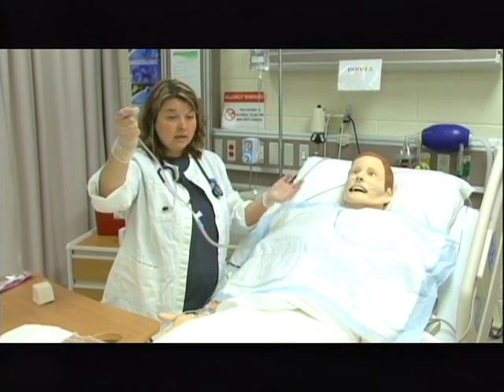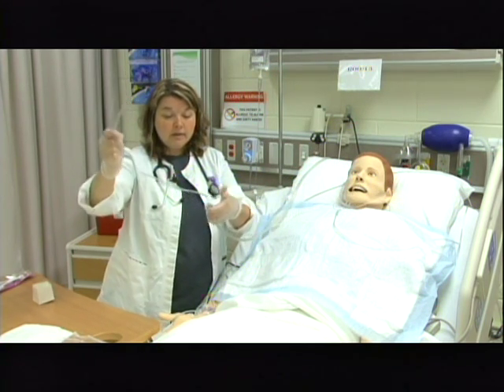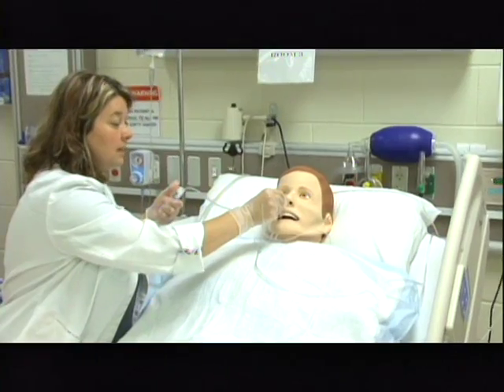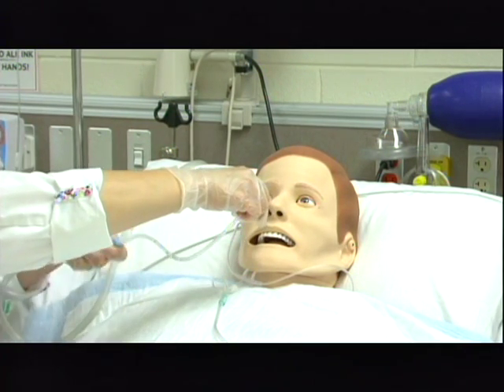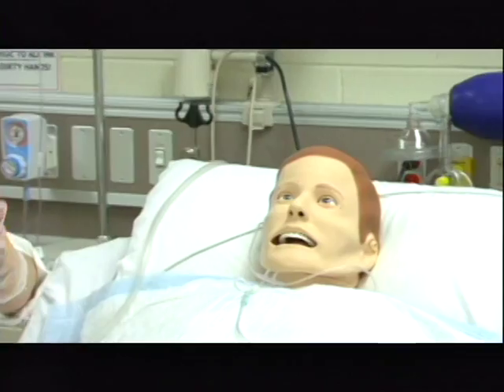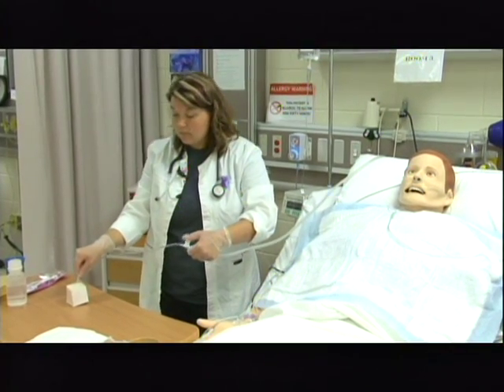Mr. Smith tells me he still has secretions, so I wait at least 30 seconds to a minute between suction passes. I allow him to catch his breath, have him take another couple of deep breaths, then pull his oxygen down with the clean hand. I come over with the suction control — I do not suction as I'm entering. I replace the suction catheter in the same nare, alternating if needed, and insert it to the appropriate length, making sure the tube does not touch anything going in. Once at the appropriate depth, I suction intermittently while pulling the catheter out and twisting as I come out. I then make sure the catheter is up and not touching anything, and with my clean hand put his oxygen back on.